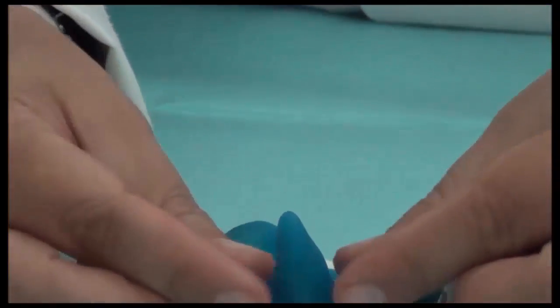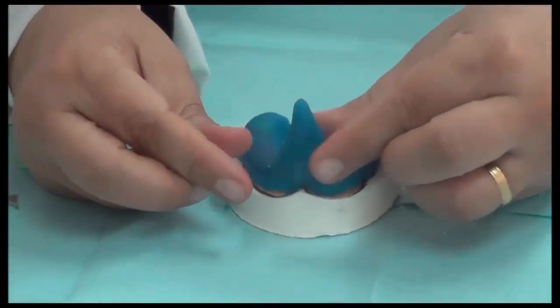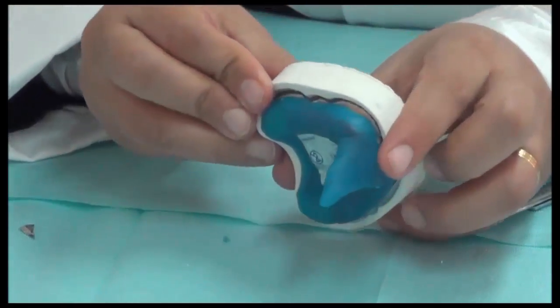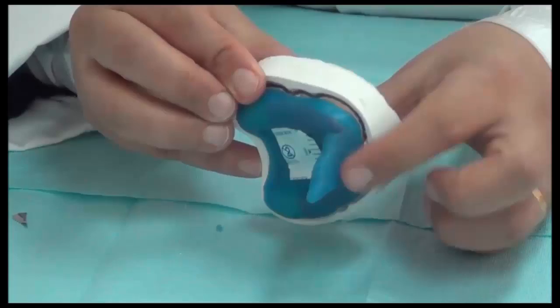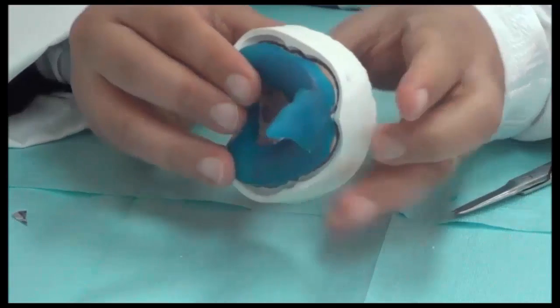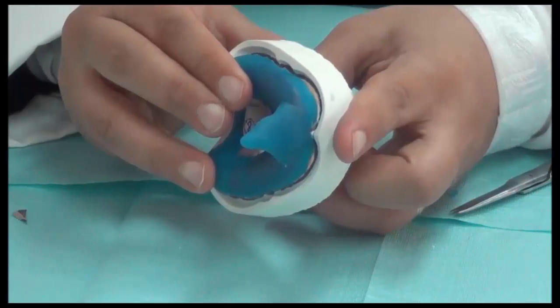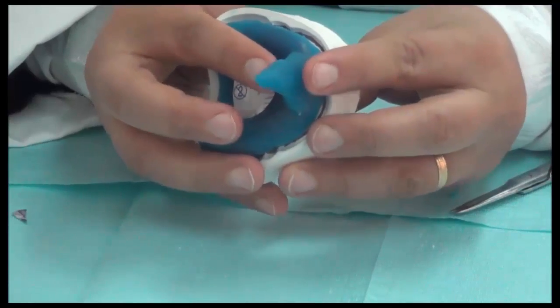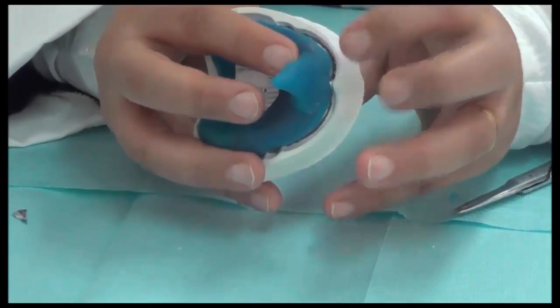Now for this part, we elongate it, and we can put our finger to mimic the lip. So this is our finger, it mimics the lip. We need to make sure that the body of the handle doesn't interfere, because if it was like this, the lip will be pressed away from its location, and thus the sulcus will not be recorded correctly. So we need to put our finger in the first 2/3 of this to make sure that the lip is not interfered with by the handle.